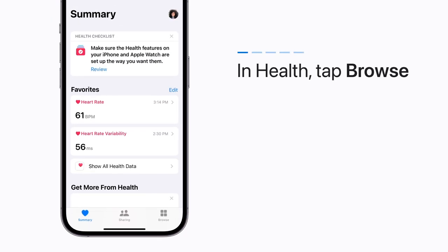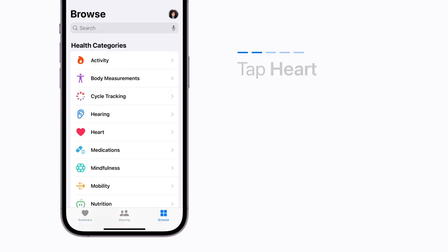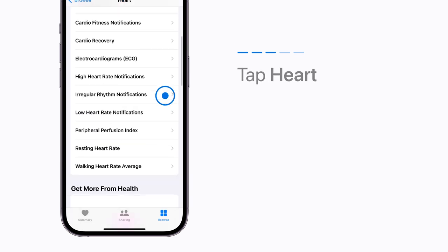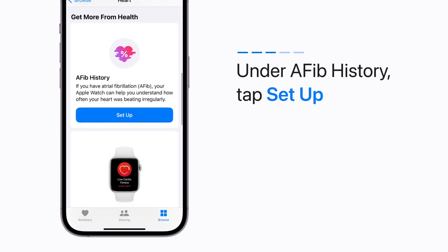On your iPhone, tap Browse in the Health app, then tap Heart. Scroll down to the Get More from Your Health section and under AFib History, tap Setup.